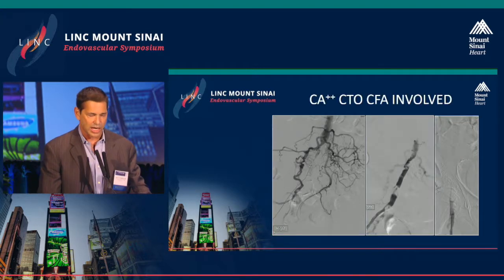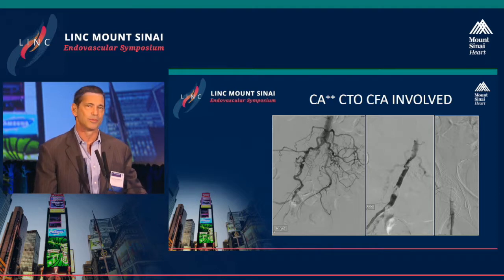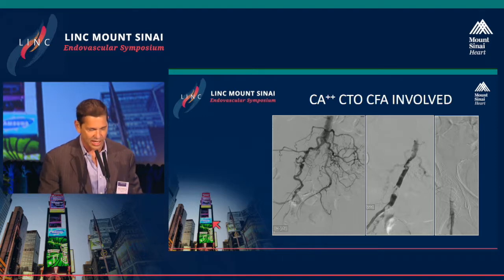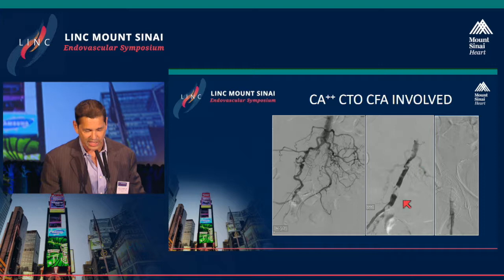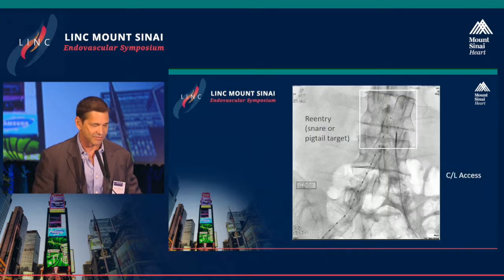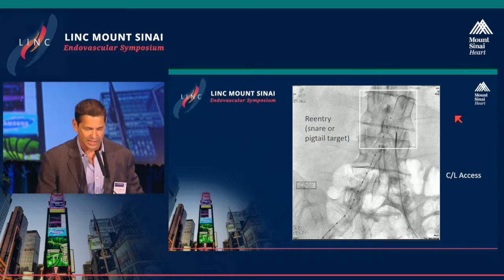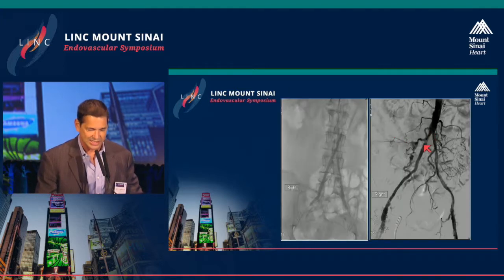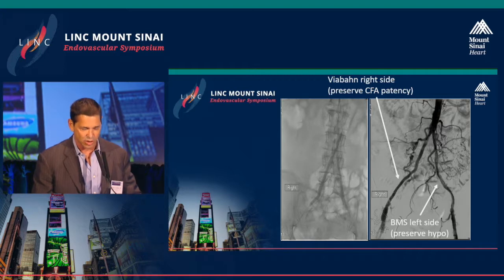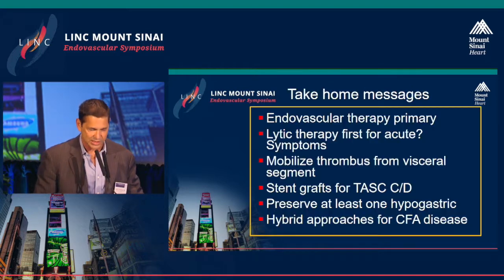Moving on to something slightly more complex — this case involves the common femoral artery calcified CTO, which is sort of daily practice for us. You can see there is no identifiable bifurcation — neither common nor external iliac is visible, all collateralized on the ipsilateral femoral injection. Dense popcorn calcification throughout and a calcified occlusion at the common femoral. This case is done as a hybrid — an open surgical patch endarterectomy at the common femoral site, then retrograde subintimal passage using a pigtail for reentry on the left side. Once intraluminal, we reconstruct with a stent graft on the right and a bare metal stent on the left, with the goal to preserve the hypogastric on at least one side while assuring best possible patency with the stent graft on the contralateral side.